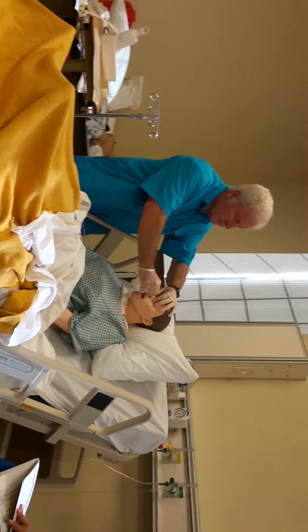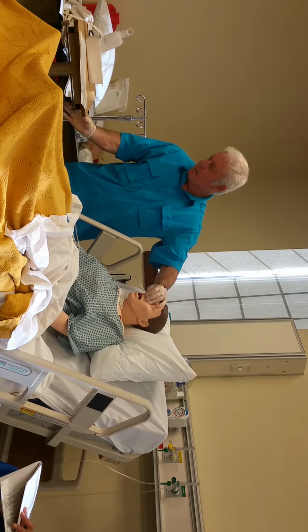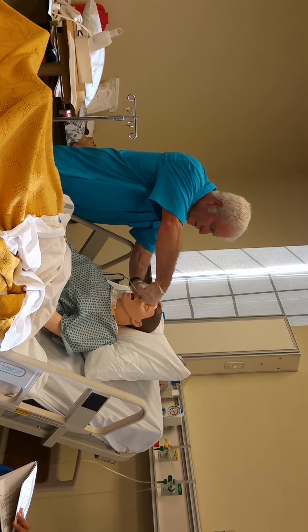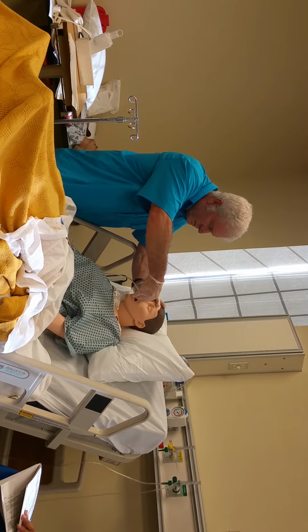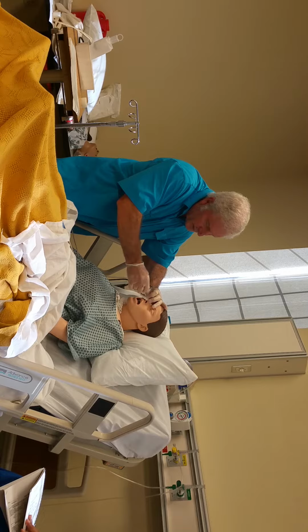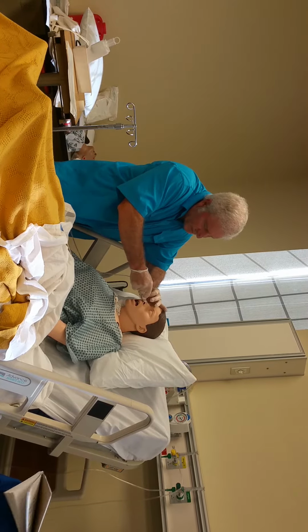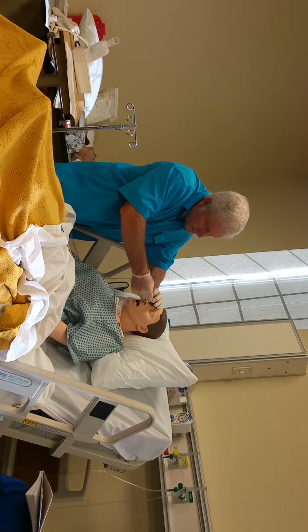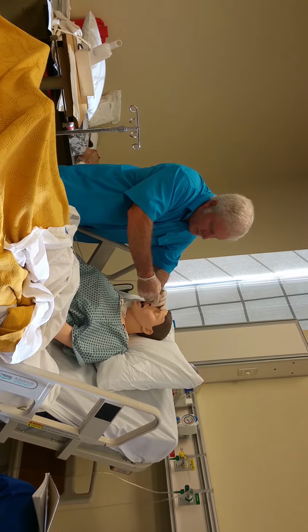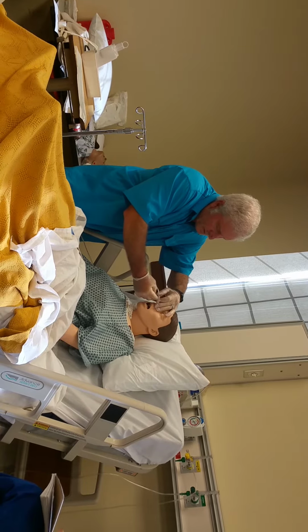Okay, so he's got it right there. I have to verify it, right? Well, I'm not going to let go of this. I'm by myself. I couldn't get a tech to help me. So I'm going to put this on his nose. You just pull these apart. It doesn't matter which side you do first. You just wind one side around, like so. And then wind the other side around, like so.